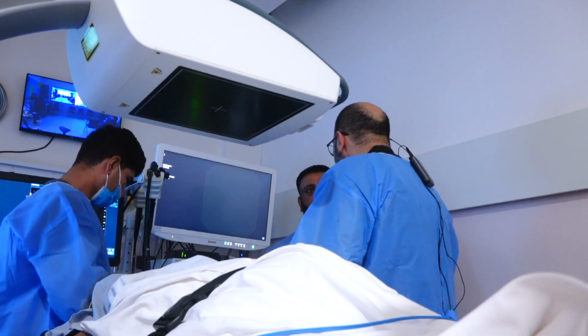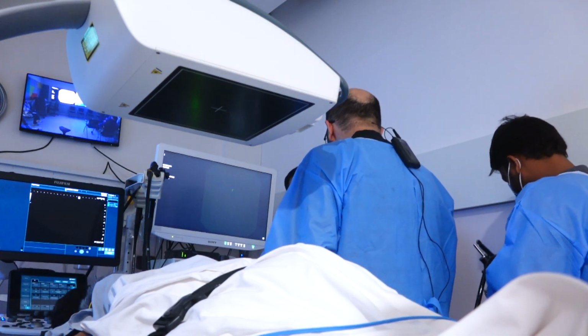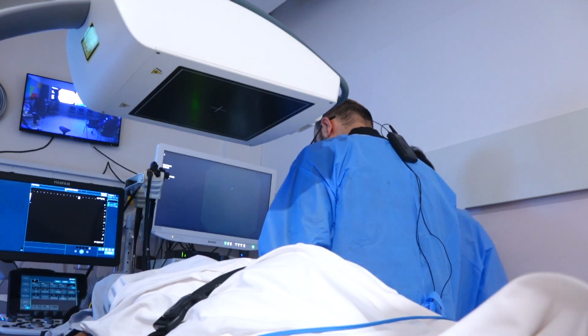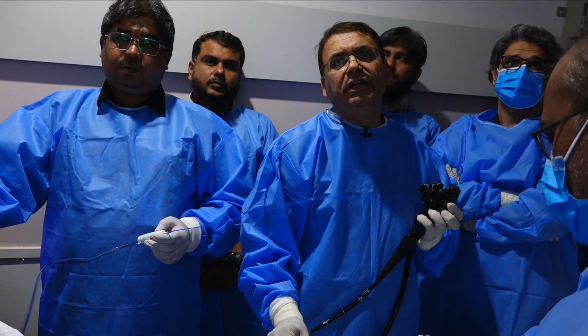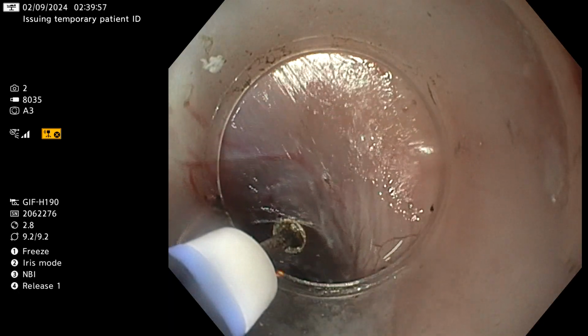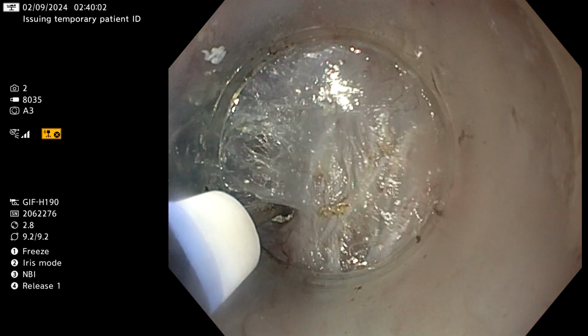Khalid, we are with you. Can you hear me? Yes, we can, and we can see it as well. So you see the GE junction right here? Yes, we can see that muscle and all those spindle vessels. So we have completed the tunnel already. Oh, that was awesome.